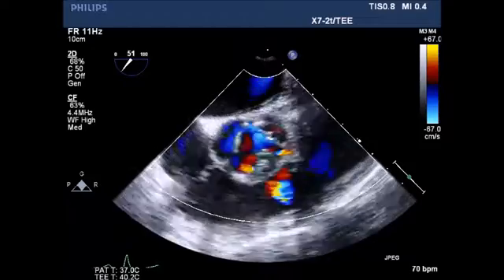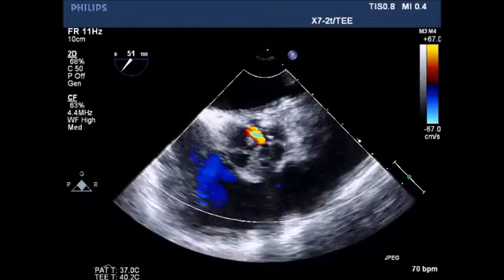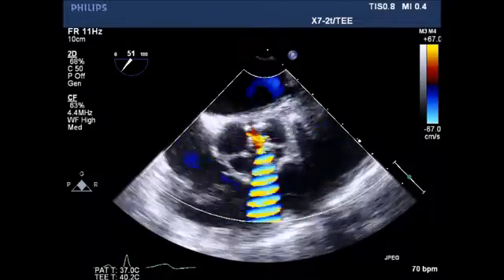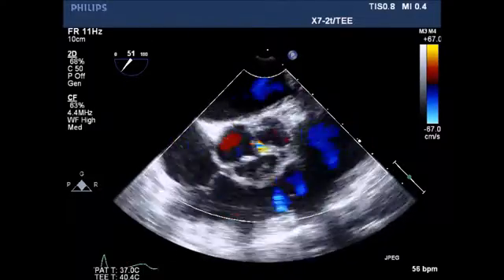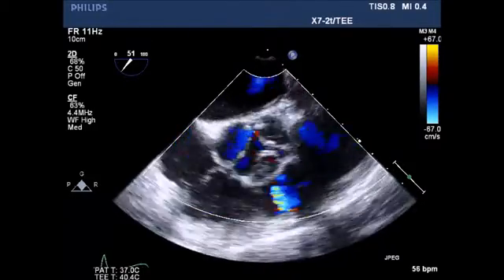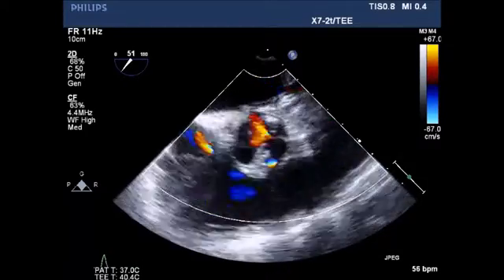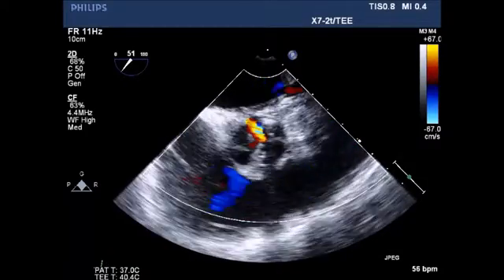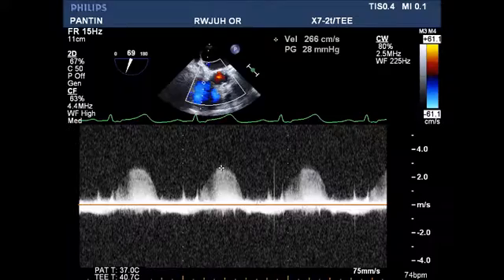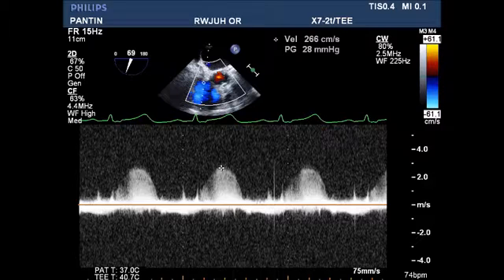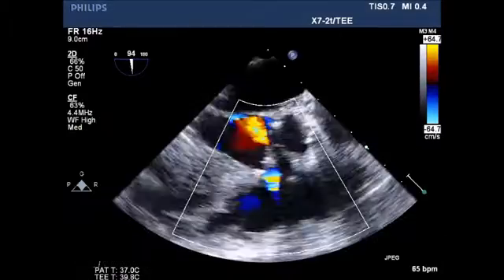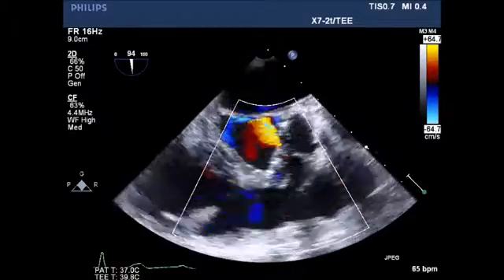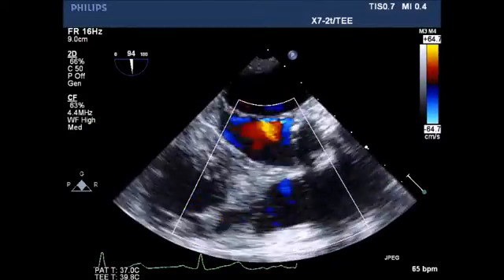Color Doppler demonstrates some aortic insufficiency, as well as color in the right ventricular outflow tract. Pressure gradient done through the tricuspid valve, demonstrating a right ventricular systolic pressure of 28 millimeters of mercury.